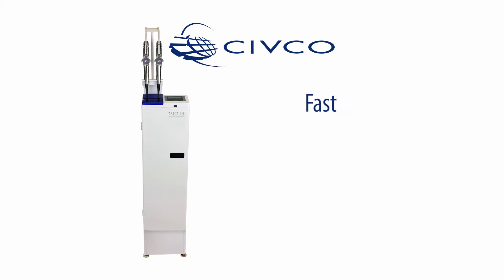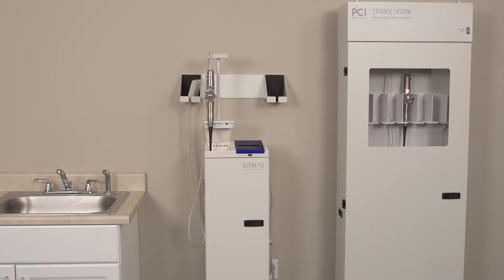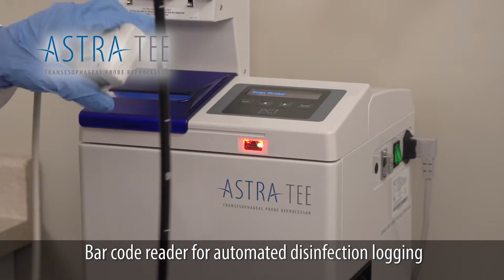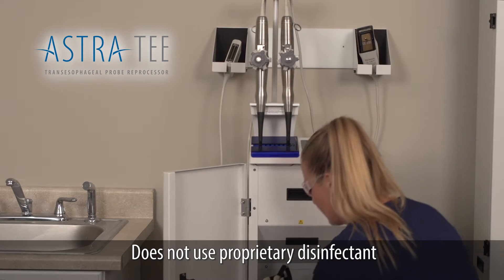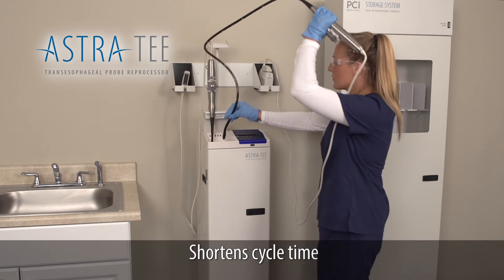Astra is fast, easy to use, cost-efficient, and improves workflow. Astra is the automated reprocessor for TEE probes that has a barcode reader for automated disinfection logging, does not use an expensive proprietary disinfectant, disinfects one or two probes at a time, and shortens cycle time.